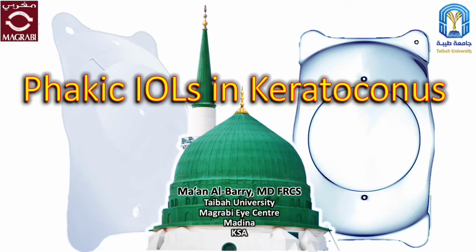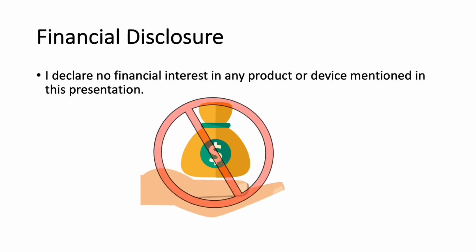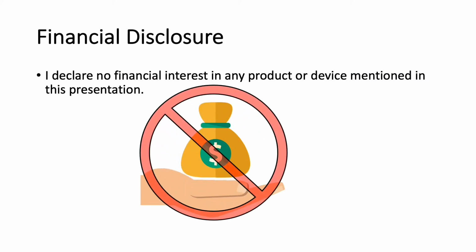Bismillah ir-Rahman ir-Rahim. I'm Dr. Moain Al-Barri from Taibah University, Maghribi Eye Center, Medina, Saudi Arabia. I'll be talking about Phakic IOLs in keratoconus. I declare no financial interest in any product or device mentioned in this presentation.